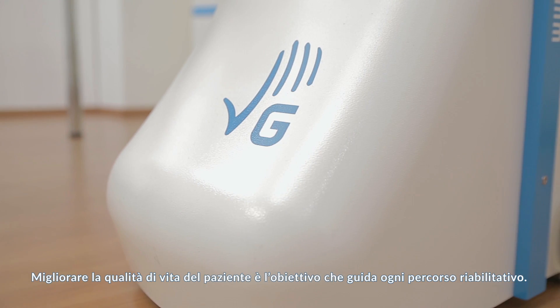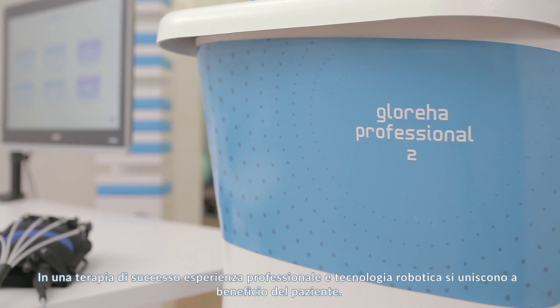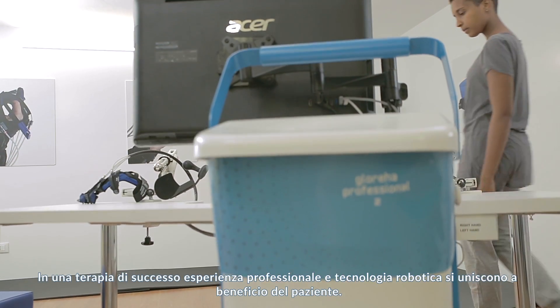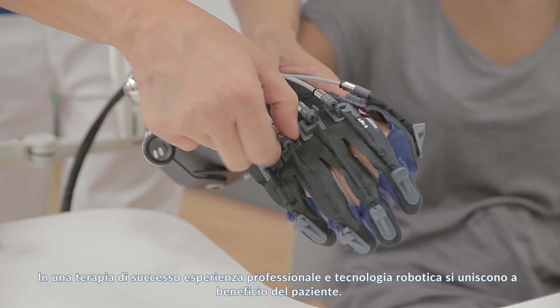Enhancing patient quality of life is the key goal of every rehabilitation process. Successful therapy combines professional support and robotic technology to achieve the best well-being outcomes for patients.